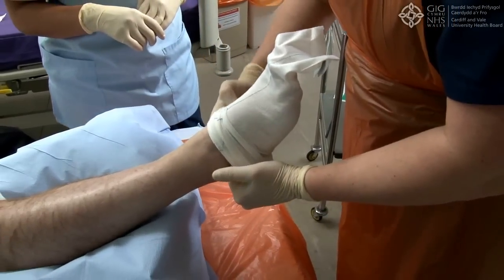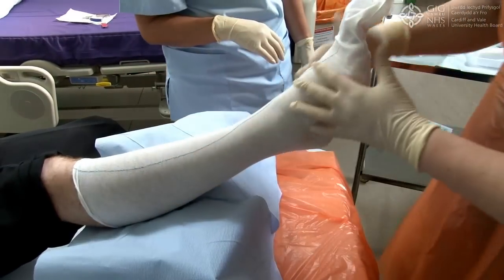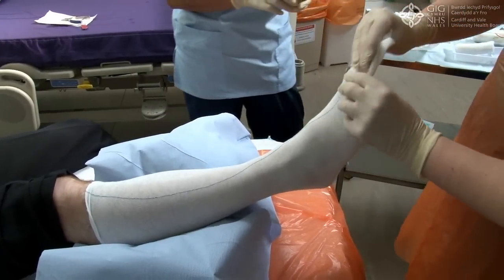Apply 1 layer of blue or yellow line Tubifast from the knee to the toes. The use of blue or yellow line will be dependent on the size and edema levels of the foot.